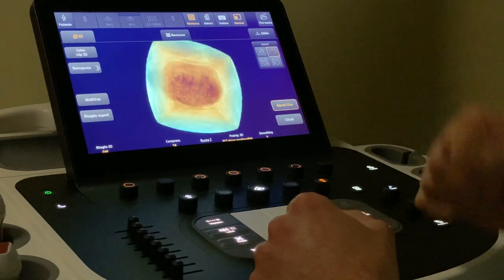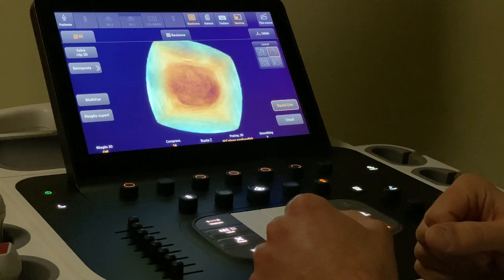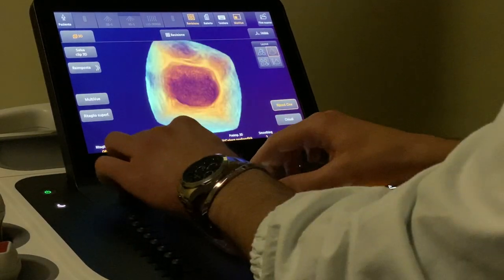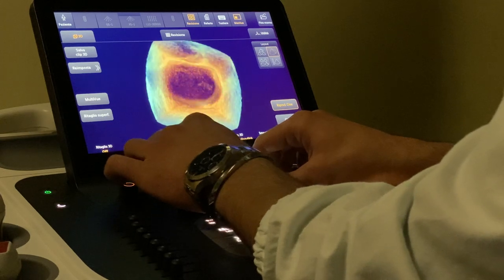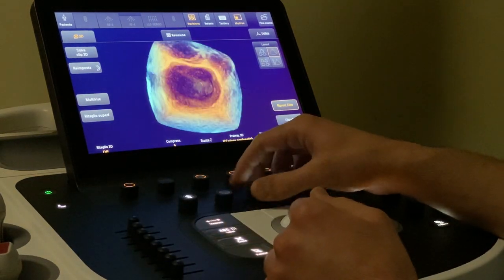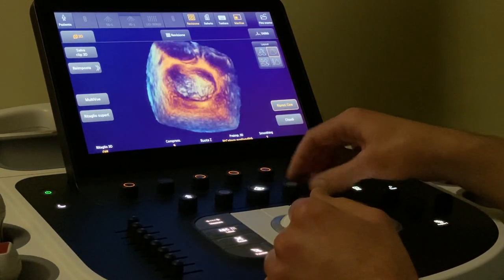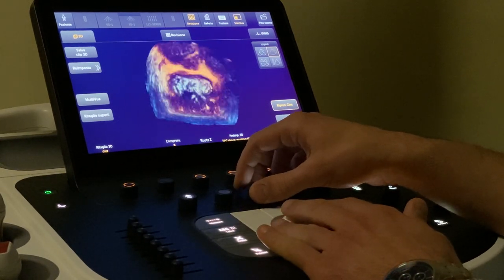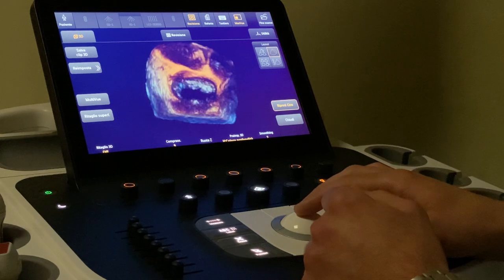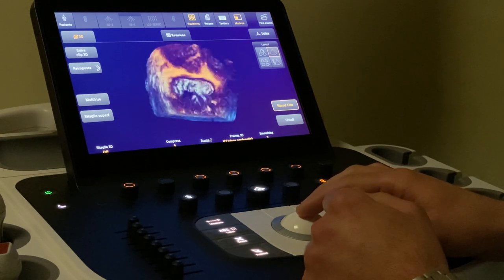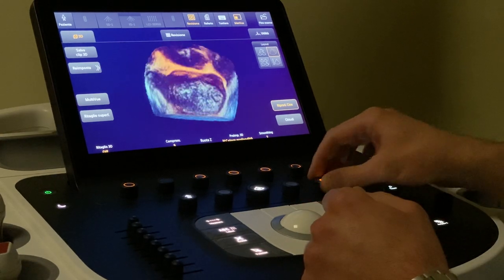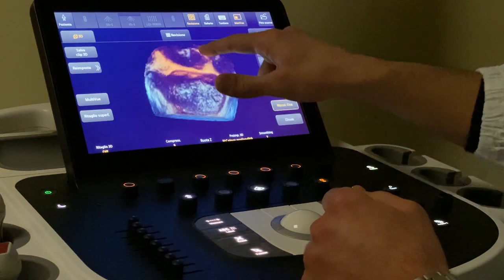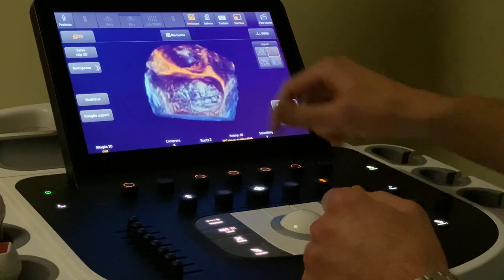We will take some gain out because the acquisition has been made with more gain than normal. We can take some gain out and we can see that the mitral valve is more evident. We can see the left appendage, the aortic valve, and the tricuspid valve.